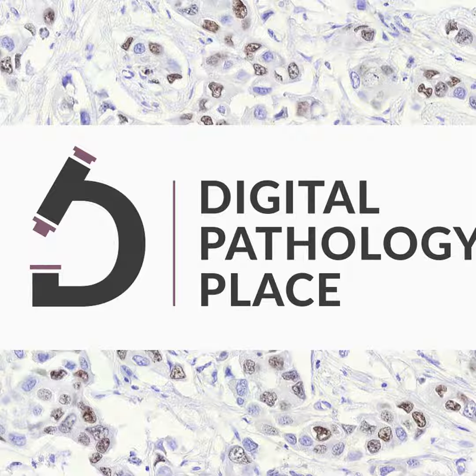So that's the rationale for the system, is that the scanner, at least the way we make them today, is not useful as a comparator. So you need to add viewing software. And so our viewing software is called ViewPath. It's now called Navify DP, Navify Digital Pathology. And we had to choose actually a specific monitor, and it was an ASUS brand monitor.